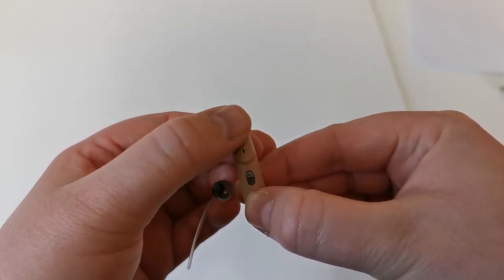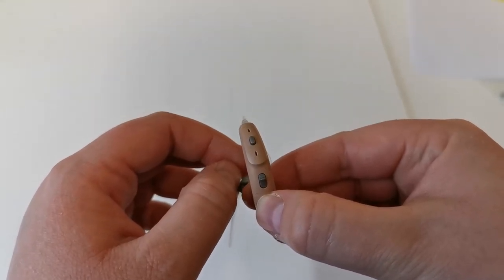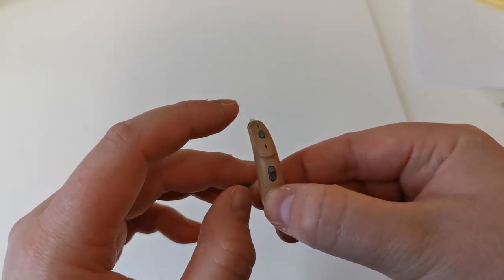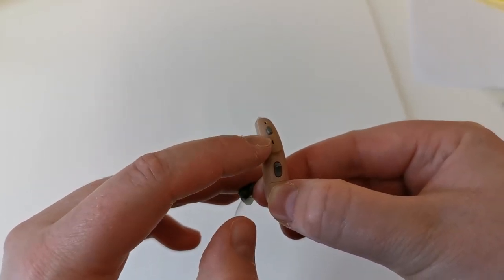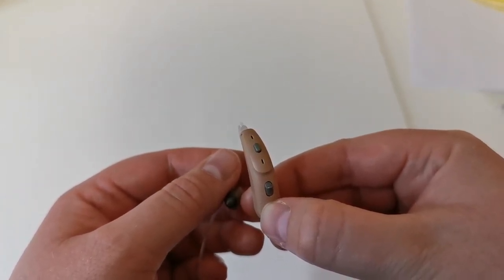There is a program button on the hearing aid. The audiologist will let you know if you have any additional programs on your hearing aids. Next to the program button there are the microphones. It's important to keep this clean, otherwise sound will not be picked up by the hearing aid.